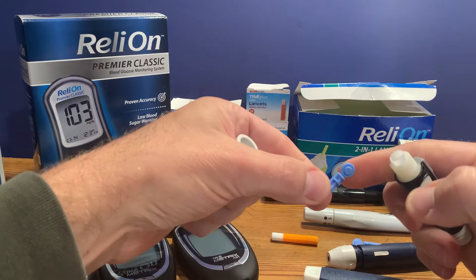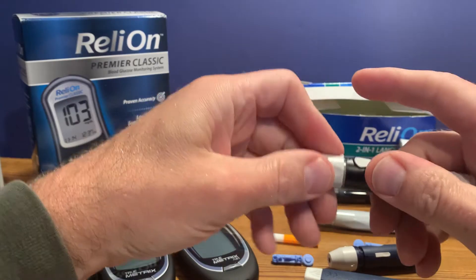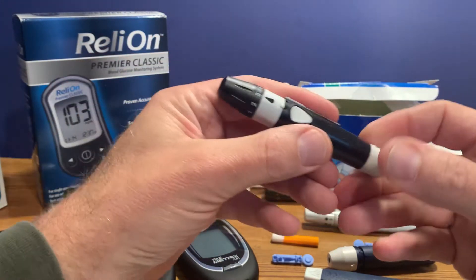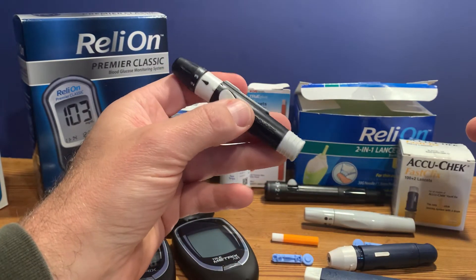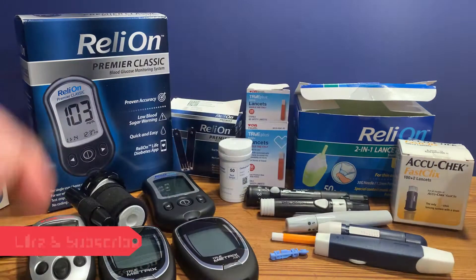You put the lancet in, remove the protective cap, put the cap back on, set the depth, load it, and press it to poke your finger. There are several different versions of those devices, but they all work on a similar principle.